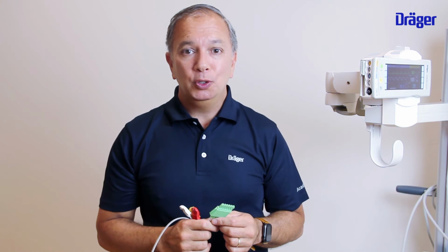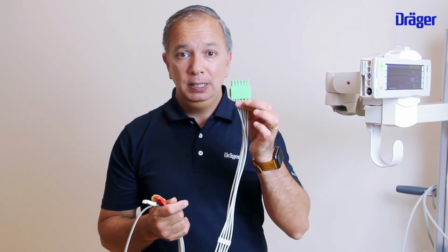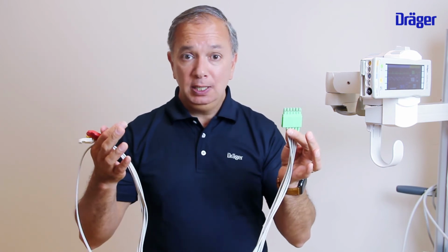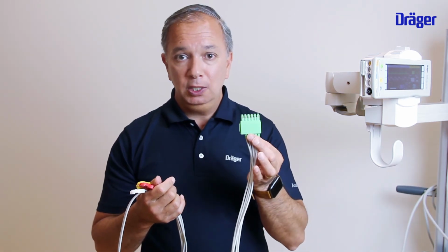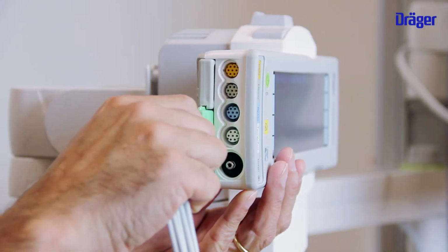I will show you how to connect your patient cables into the monitor. The first one is ECG. So you have 2 different options. You have the ECG cable and you have the ECG extension cable, which you can connect to this ECG cable. The first option is to connect your ECG cable directly into the monitor, like this.